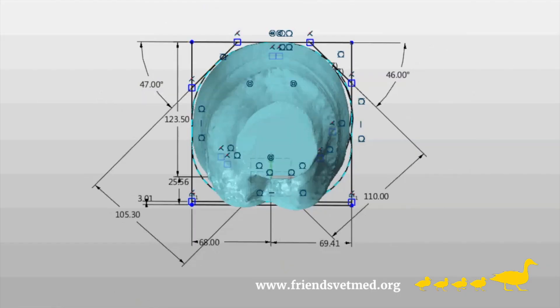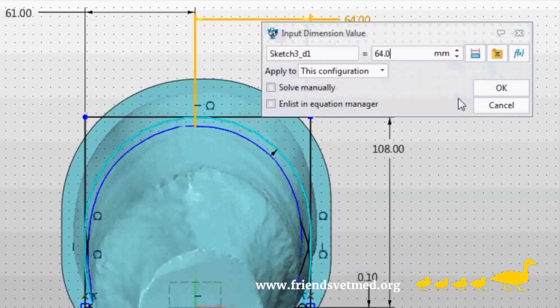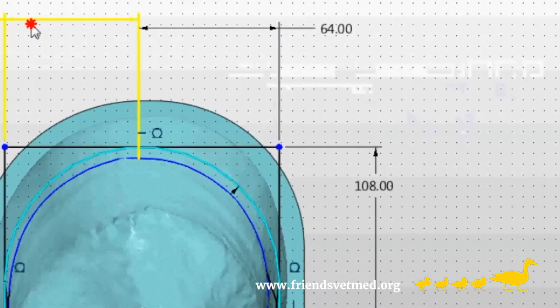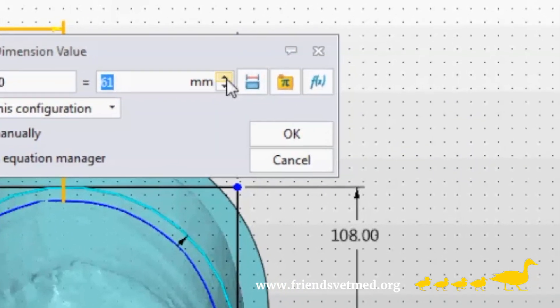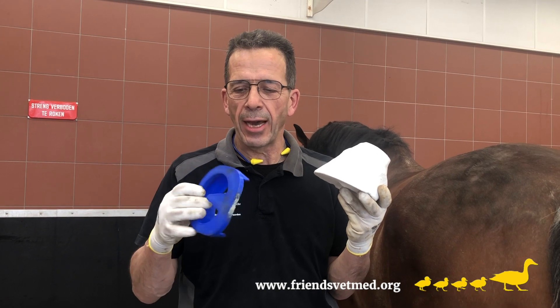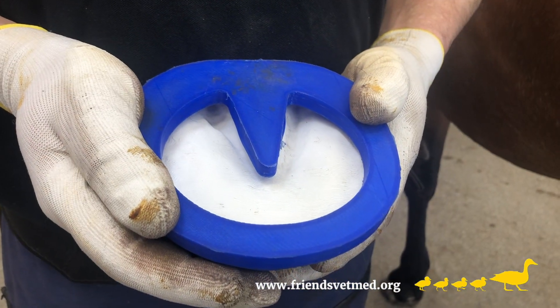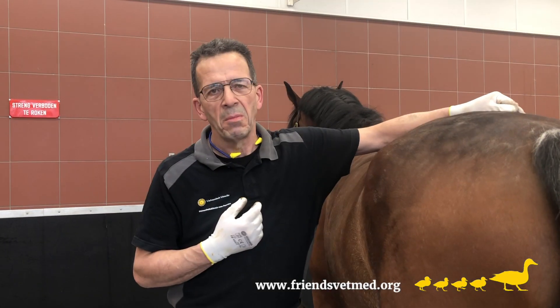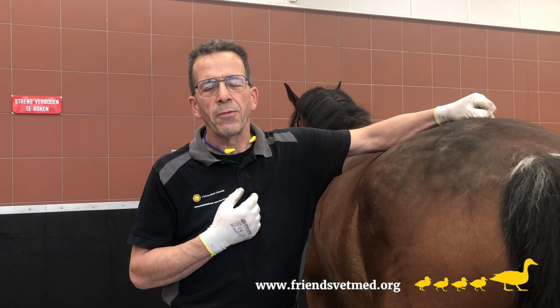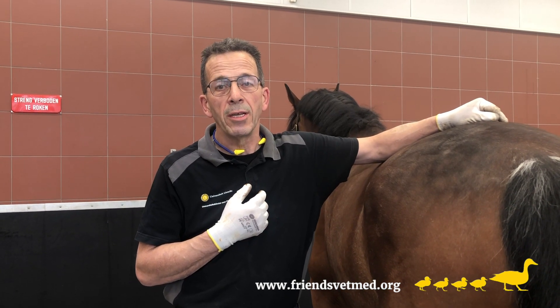We realized that we'd be able to add lots of different features to our 3D horseshoe. Once the design is ready, all we'd need to do is push a button and the printer produces what we've had in mind. So we've scanned a foot and this is the result. Obviously this is a prototype and will need to be improved on. We think that 3D horseshoes might have real potential to influence the welfare of our horses for the better.